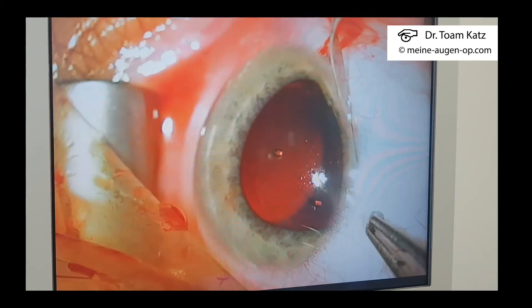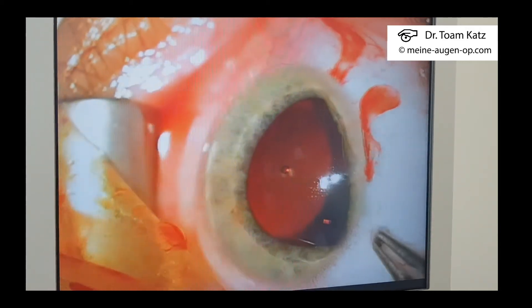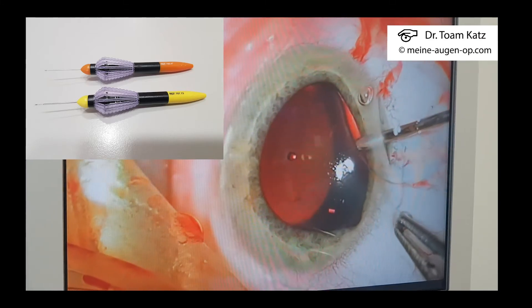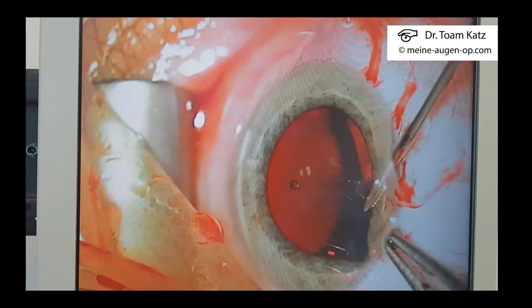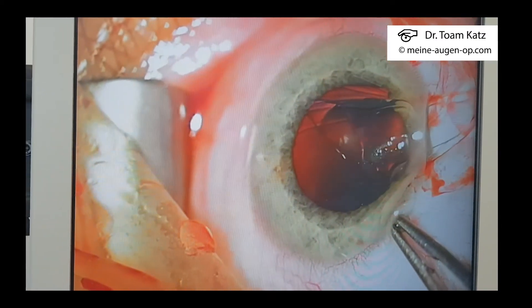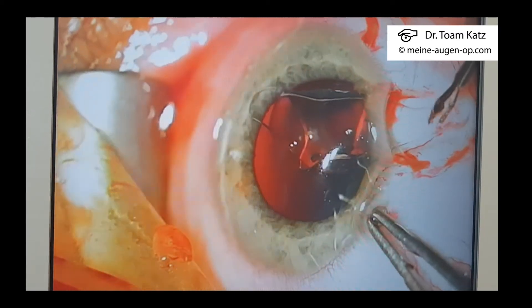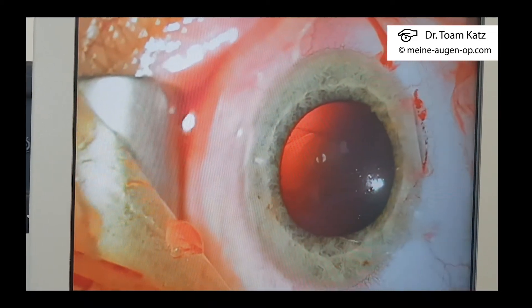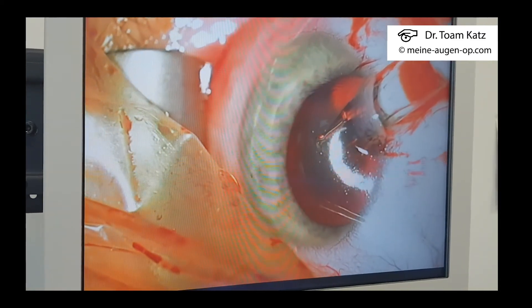Then we use the standard three millimeter tunnel — a new tunnel, which we normally use to implant an ICL. Through this tunnel we use a forceps of 20G or 23G with crocodile teeth. With this forceps we grasp the haptic at the neck, and we just pull slowly and continuously through the three millimeter tunnel. The lens folds on itself and comes out in one piece. There is no need to insert other instruments into the eye.